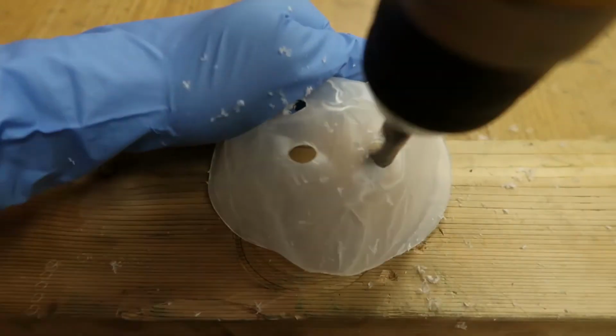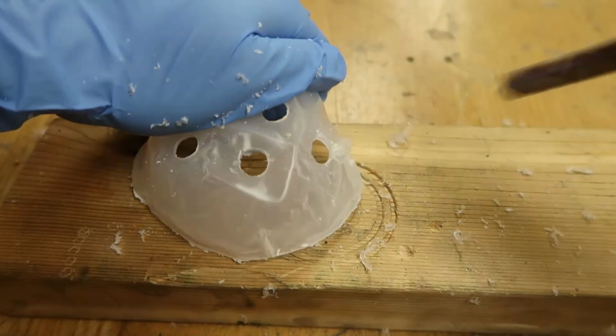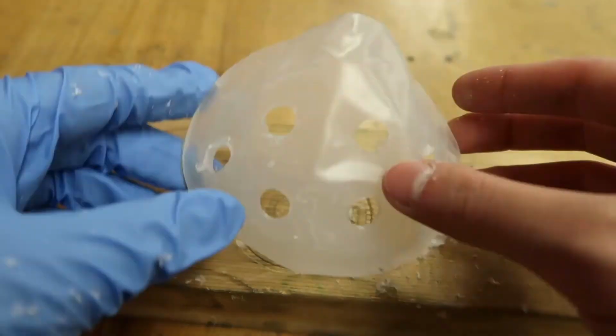Then I drill some holes on the mask bracket so air can go through when I breathe. And there you have it. You now have a mask bracket that you can use under your mask so you can breathe and talk more comfortably while wearing a mask.